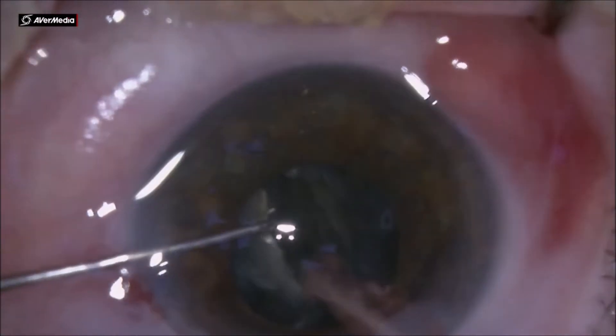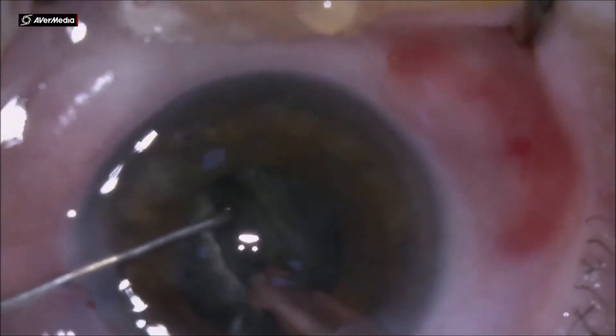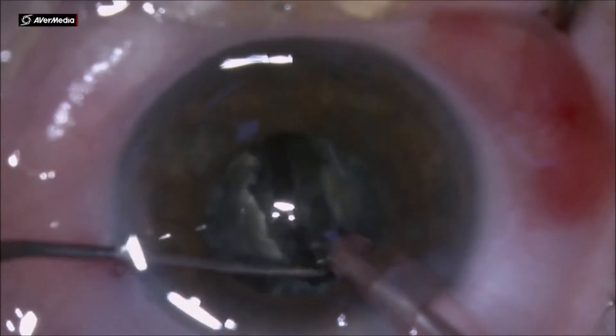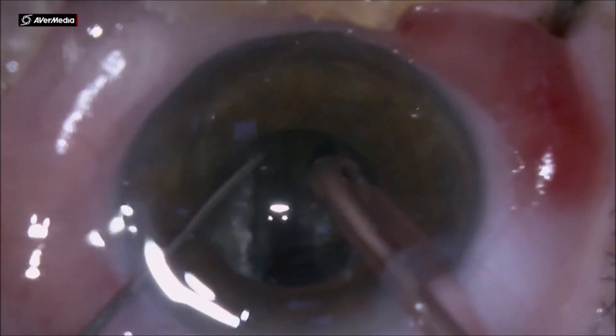Using the chopper — notice that I rotate the chopper in order to have as much contact with the nucleus as possible — I am able to split the two heminuclei down to the posterior plate. A nice crack in the posterior plate will make the surgery easier.